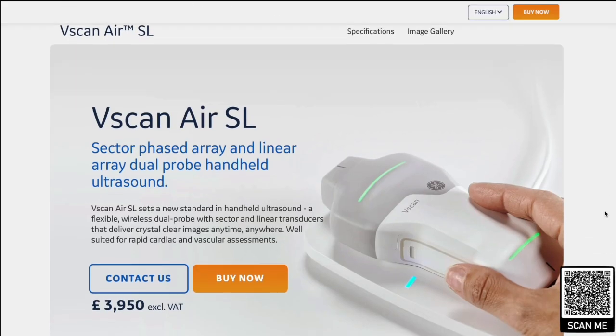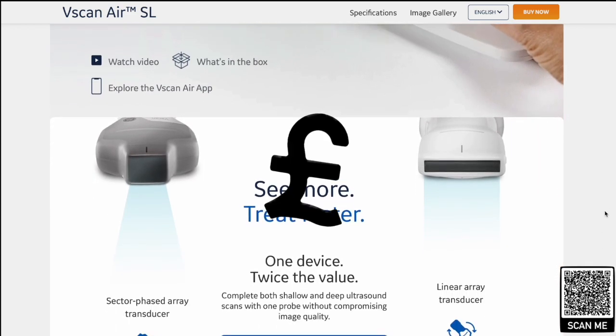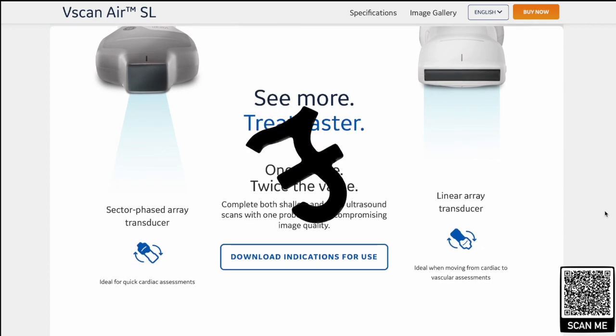The review has been performed by three of us: my good friend Marcus Peck, Ashley Miller, and myself. We're all consultant anaesthetists and intensive care consultants, working in various different venues throughout the UK. Looking at the website, you can see that GE have priced it at £3,950.